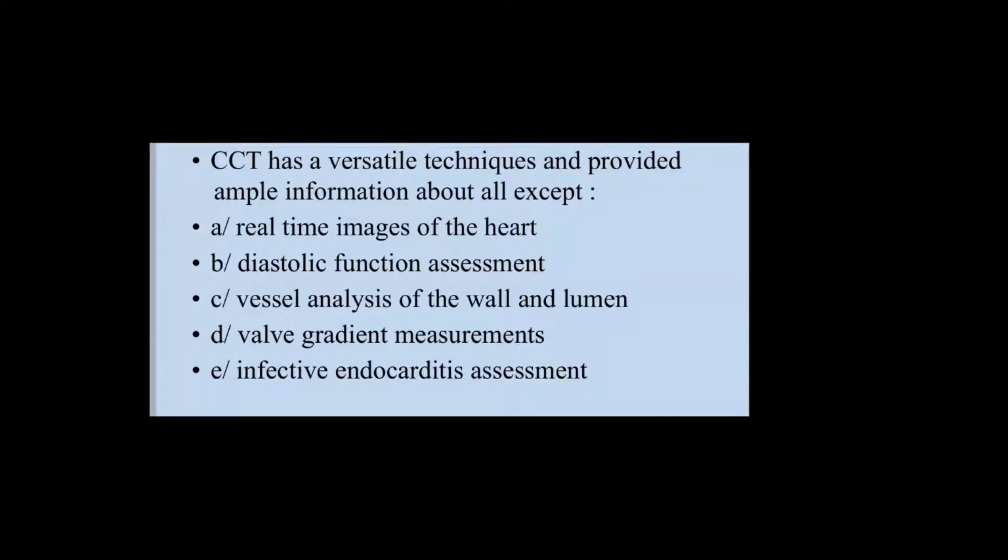Gradient measurement. Yes. Gradient measurement. Because, you know, in CT you have functional data. I'm going to show you now. In CT, you can have functional data. You can have the heart in real time. The heart is contracting and relaxing. And once you have that, you can employ software for the assessment of contractility and relaxation and all of that. So you can have an idea about the ejection fraction, the volume, the diastolic function.